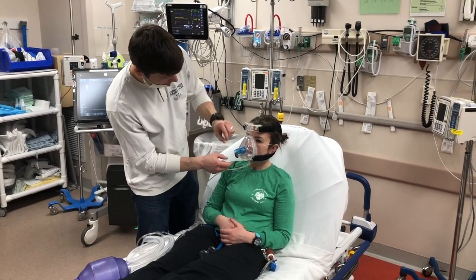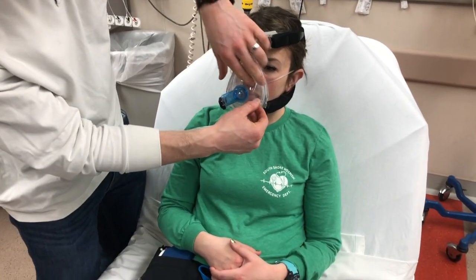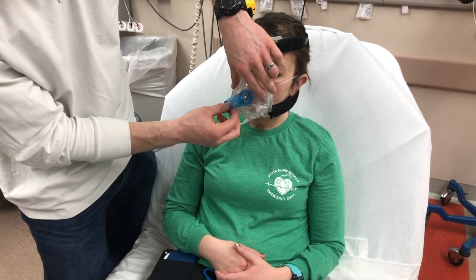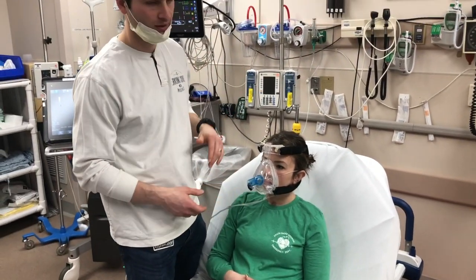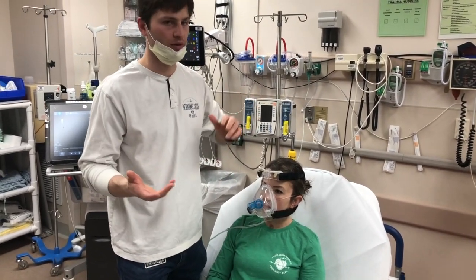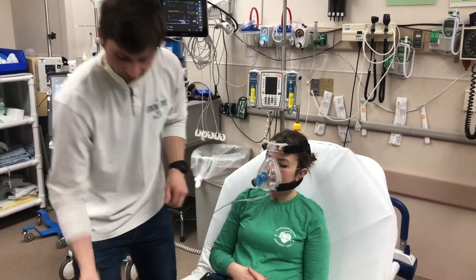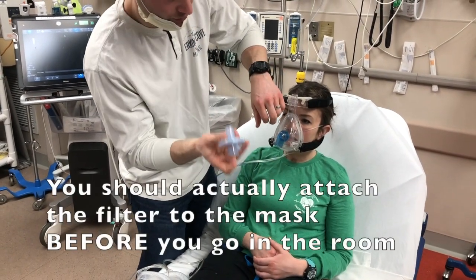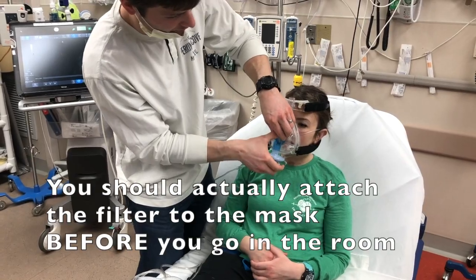These BiPAP masks have these little vents on them here — just make sure that these are closed. If your RT thinks that the patient isn't tolerating BiPAP well because of these being closed and you really have to open them up, then go ahead and do it. But to start off with, we're going to try to keep those closed. Take your viral filter — one side and one side only should fit into the BiPAP mask adapter here.